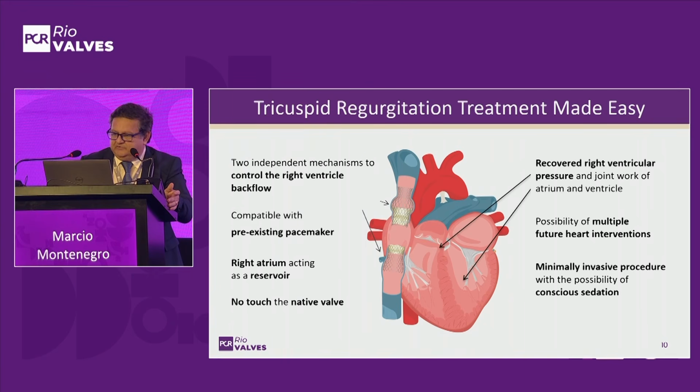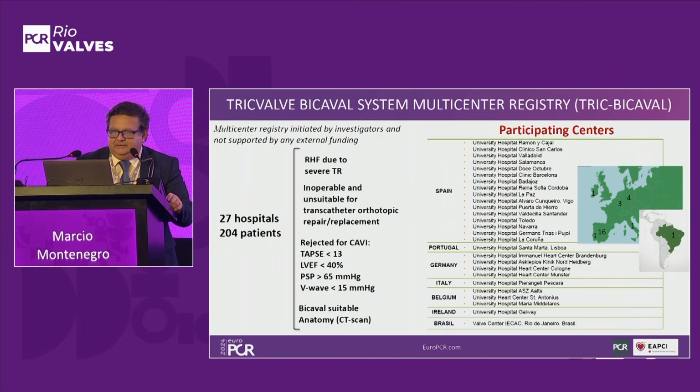A minimally invasive procedure with the possibility of conscious sedation, and now with free contrast. This registry, as I said, included 27 hospitals with more than 200 patients. Our institute was the only hospital in the Americas that participated in this study.